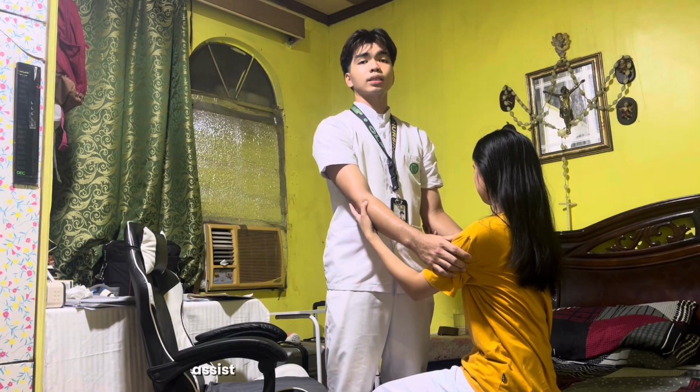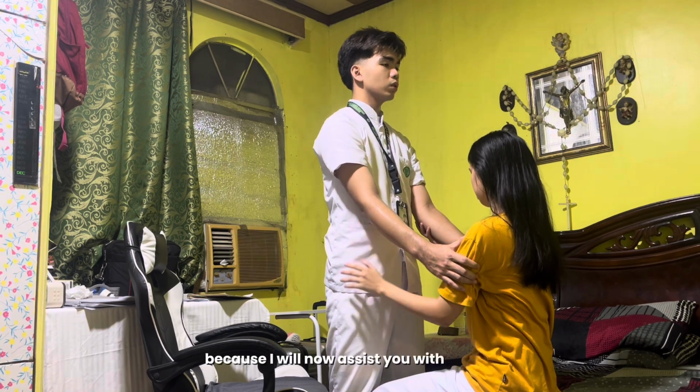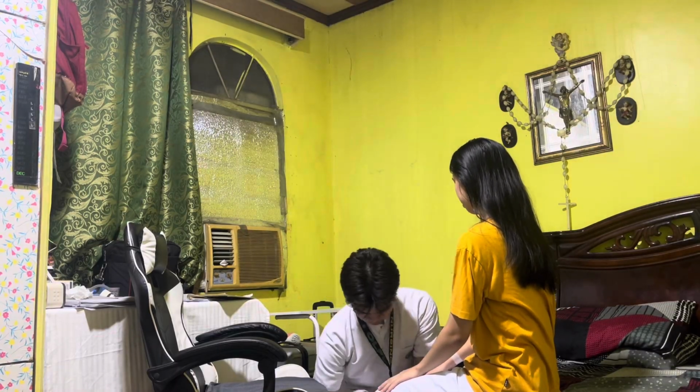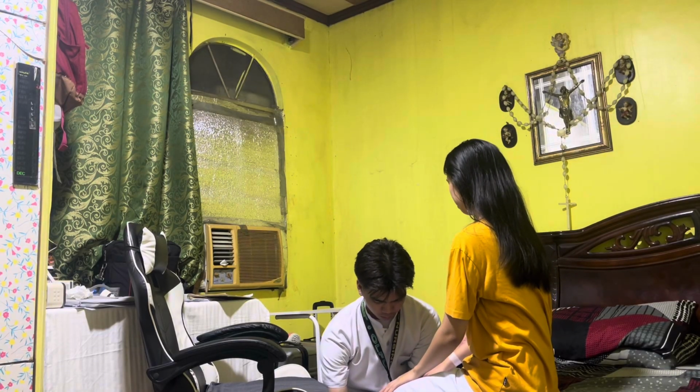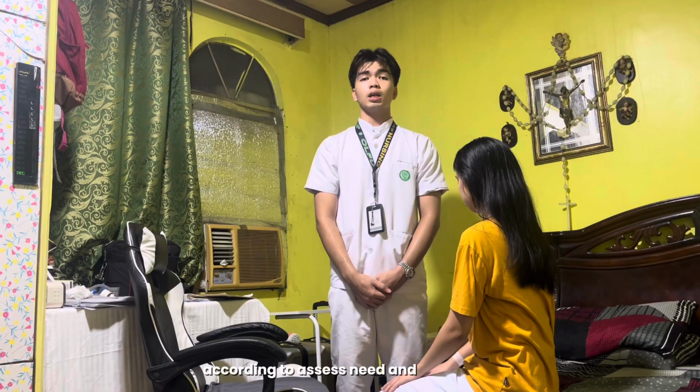Then after that is assist the patient in wearing non-skid footwear to reduce the risk of falling. So ma'am, please lower your hands because I will now assist you with your non-skid footwear to prevent slipping. Then next, secure a gait belt around the patient's waist according to assessed need and facility policy.